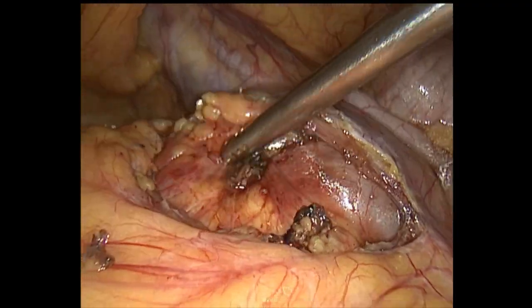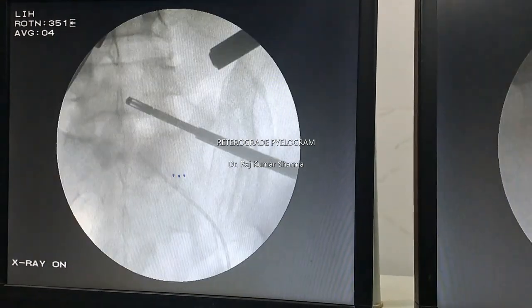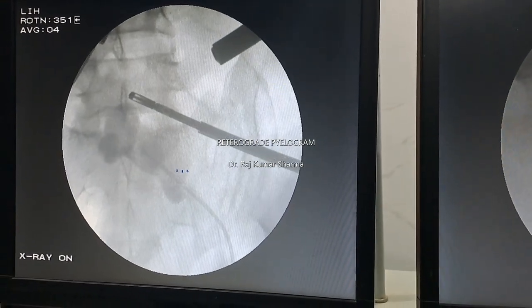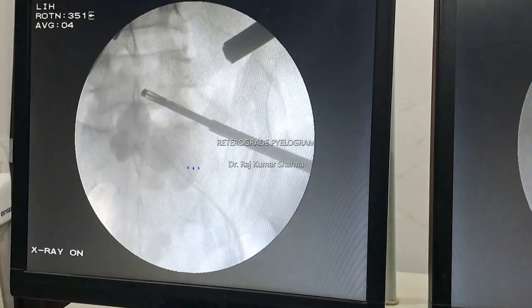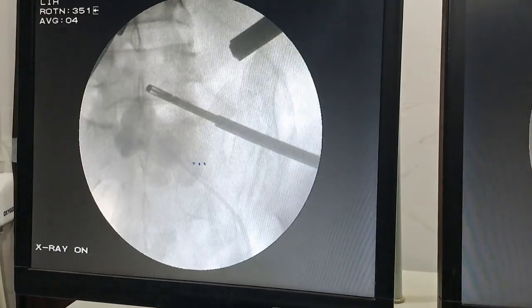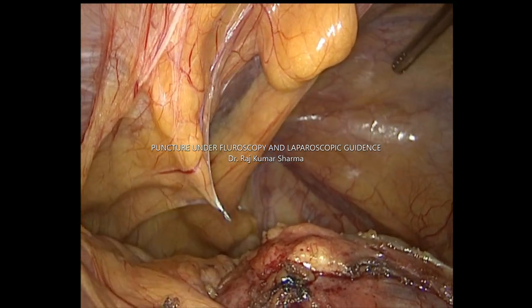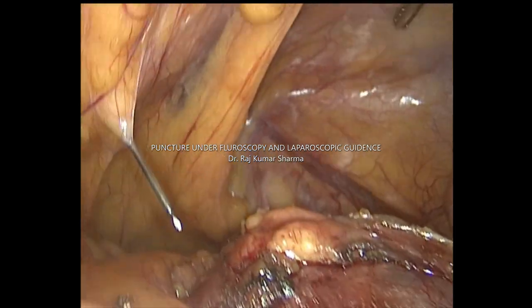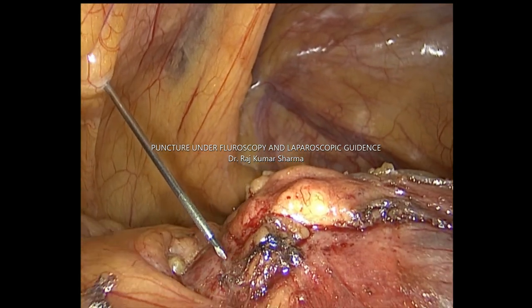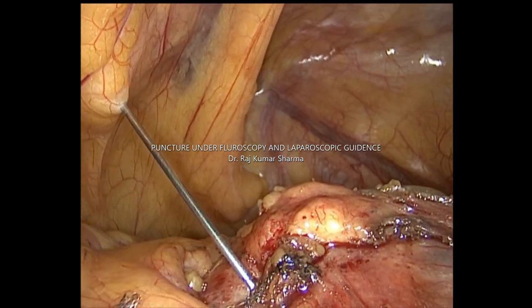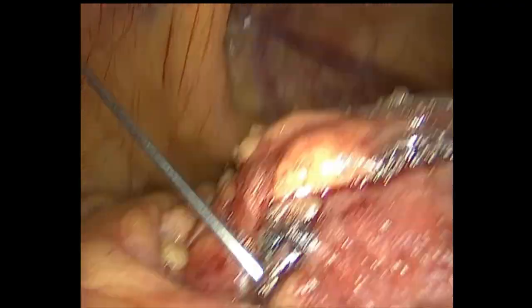Again, confirm the location of the stone under fluoroscopy. The next step is retrograde pyelography. After injecting dye from the lower ureteric catheter, we plan the puncture. Puncture is being done under both fluoroscopy as well as laparoscopic guidance. You can puncture the pelvis or calyx depending upon the stone position.